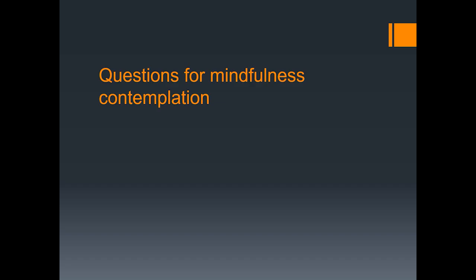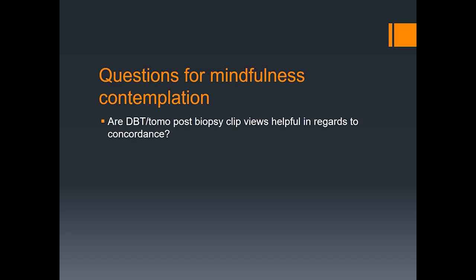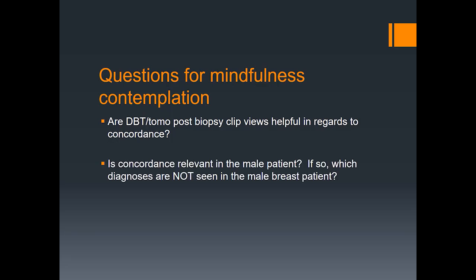As learning objectives, here are questions for mindful contemplation in regards to radiology and pathology correlation. First, are post-biopsy clip views important in 3D imaging in regards to concordance? Secondly, is concordance relevant in the male breast patient? If so, what things are not seen in the male breast patient? And we'll see this in regards to a case coming up within the lecture.